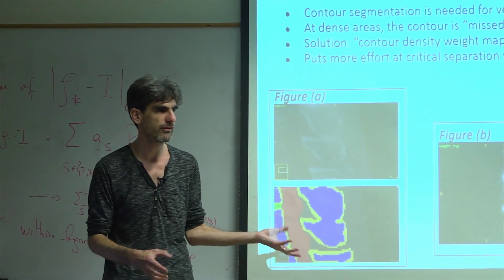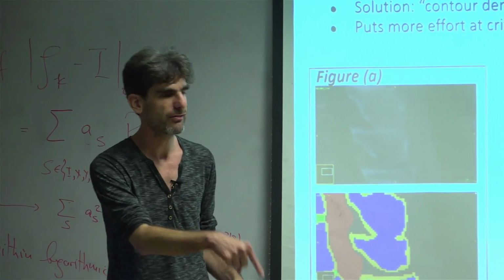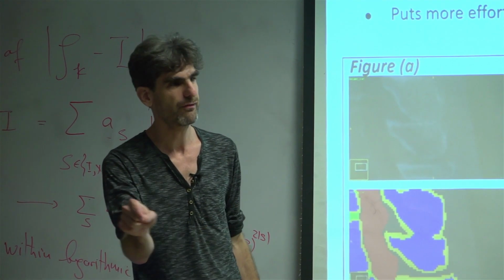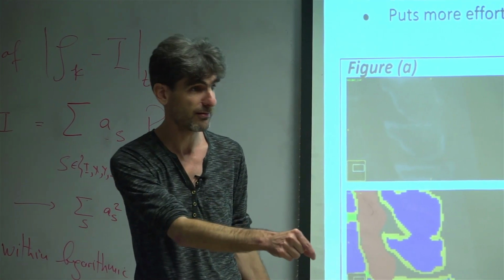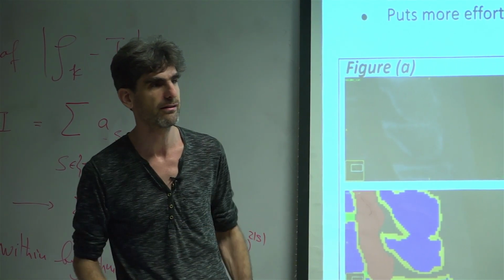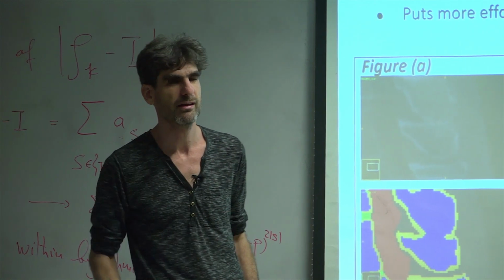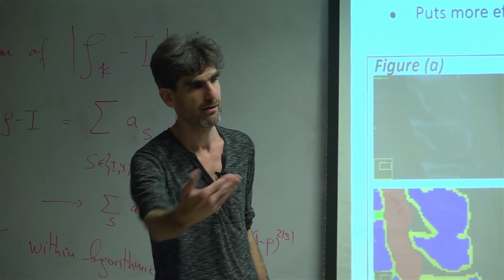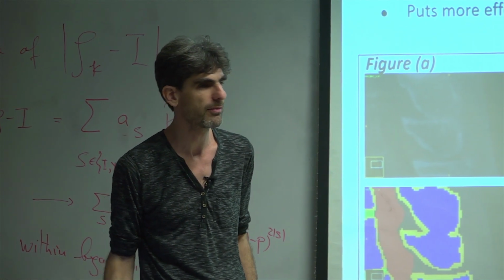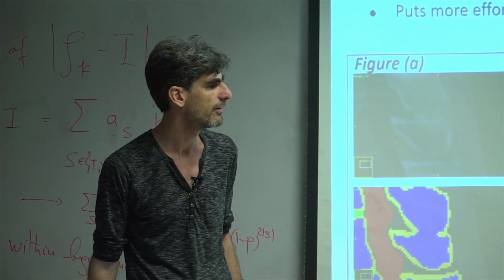So like with the registration, you have the registration, but then maybe the surgeon has to touch a certain area with the tool and see if he's really touching. So he thinks he's navigating, and then he can verify it physically by touching an identified anatomical area with the tool and seeing if the tracking is really working. So there have to be workflow-based solutions for this as well. It always needs to be verified by other means.